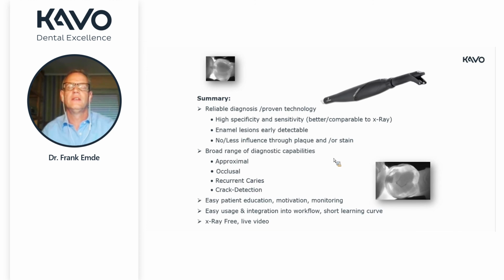If you see an indication, you might also look for the smallest size of the lesion because of projection. You have got the ability to look for the right projection, not like with X-rays. In very rare cases, it might happen that the interproximal tooth shines into the neighbor tooth, which might indicate a caries lesion, but this will go away if you just rotate the camera, and then you see that there is no more. If it's only an artifact, it will disappear.